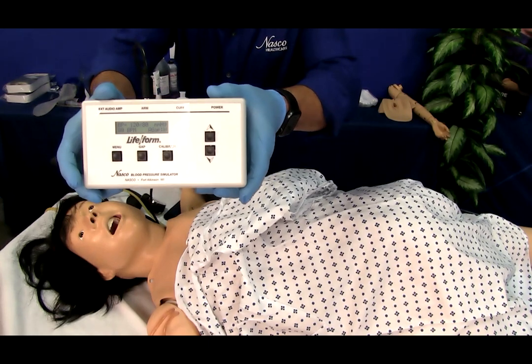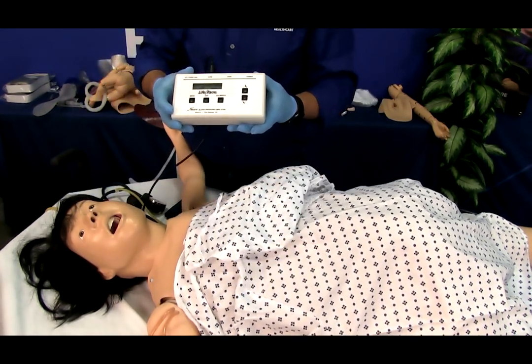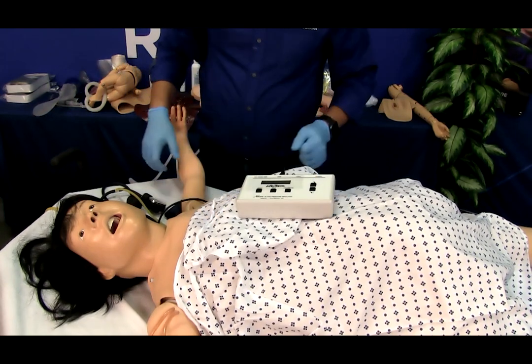Please note, the control box has a battery saving feature that will turn the unit off after approximately 8 to 10 minutes of no keys being used within that period of time.